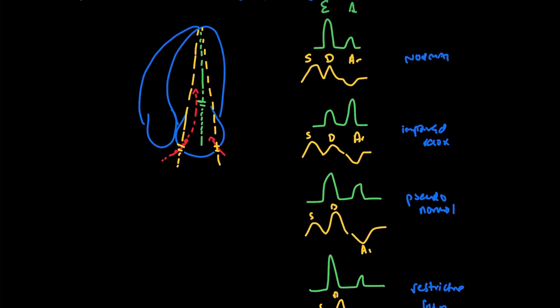And so I'm going to draw a divider here, because these ones down here are all the ones with elevated left filling pressures.